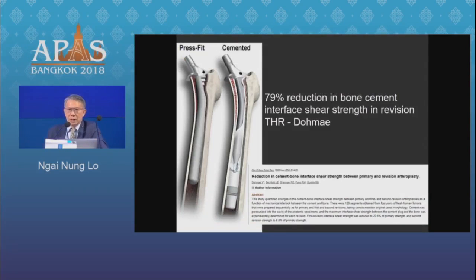Now you notice I didn't talk very much about cemented revisions, but there are proponents of cemented revisions. But in a way, a lot of times our thoughts are colored by the fact that when we knock out the old revision implant and scratch out all the membrane with the fibrous tissue and all, we're left with a patulous proximal femur and a sclerotic cortical tube.